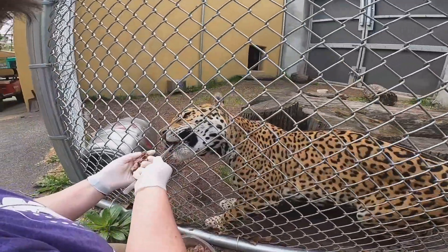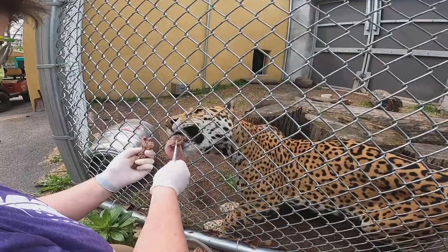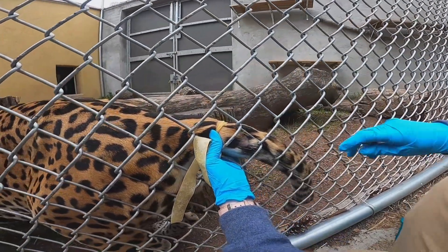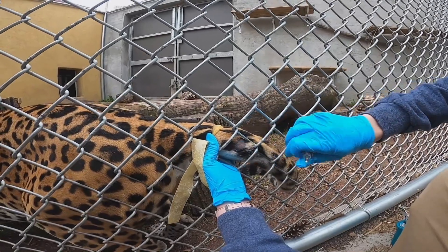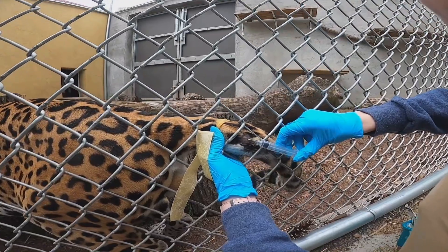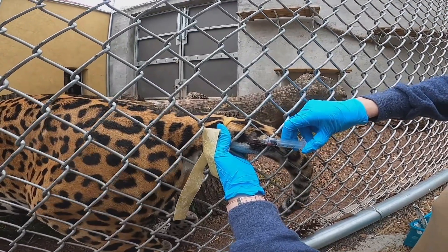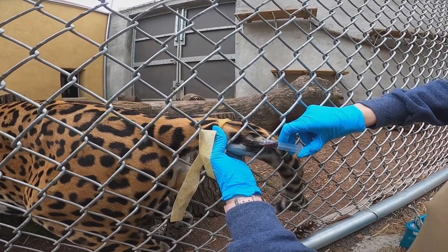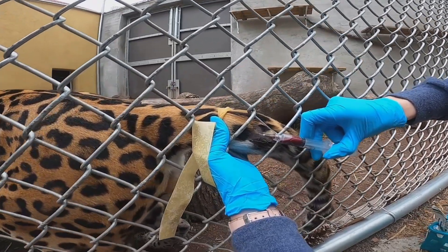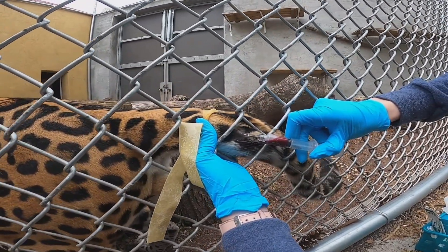While keeper Mel continues to provide positive reinforcement, Courtney prepares to collect blood from Zian's tail vein with the help of a tourniquet. Zian's blood sample will be sent out to a lab for evaluation.